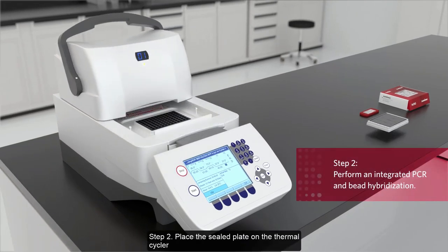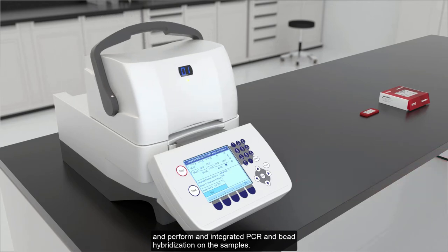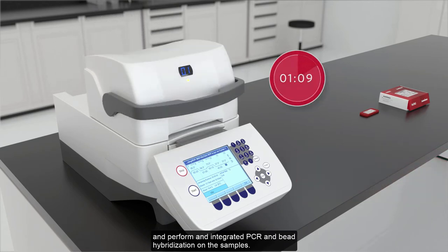Step 2: Place the sealed plate on the thermal cycler and perform an integrated PCR and bead hybridization on the samples.